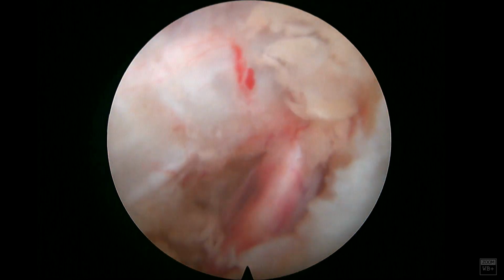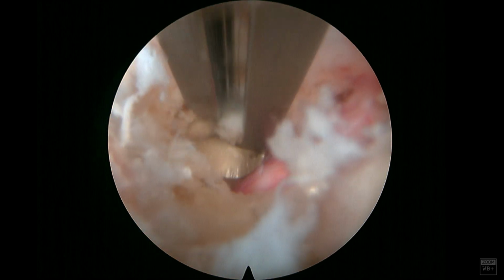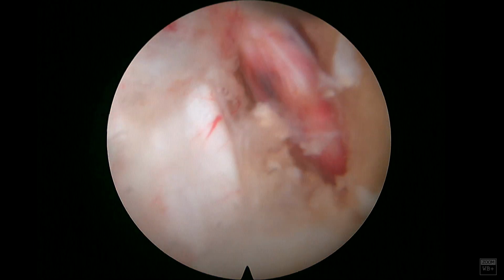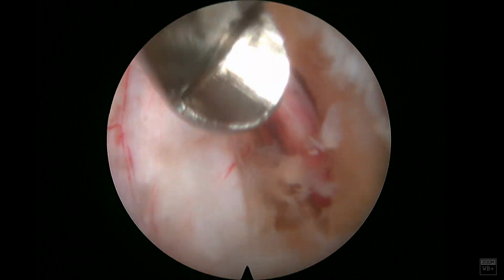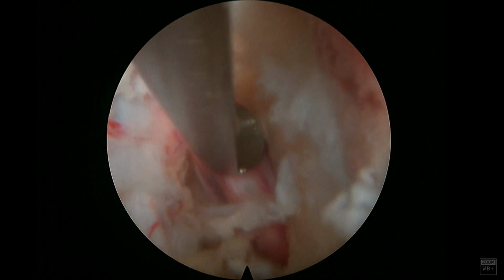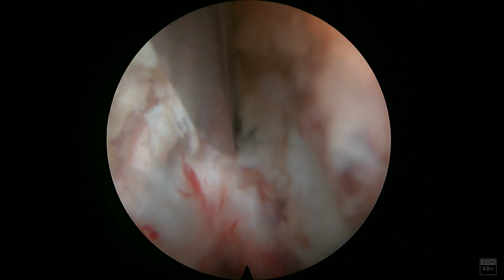Again, you have to take into account that endoscopically, this looks like it's a very large area that's decompressed, but you obviously have to realize you're working through the tube and through the camera, and so everything's magnified. And so this is what I really love about endoscopic spine surgery, is that this decompression, albeit somewhat large here through the camera, is very small. And I've had a couple of patients I've had to take back and do open decompressions for separate reasons. And when you go in and see that laminotomy, it's very tiny when you're extending it during an open procedure. And so that's the nice thing about endoscopic spine surgery.